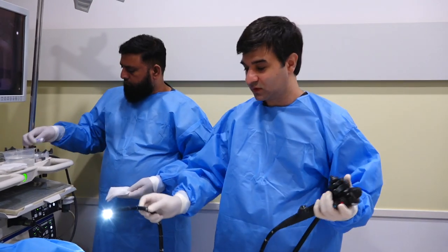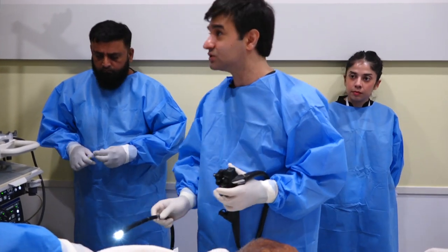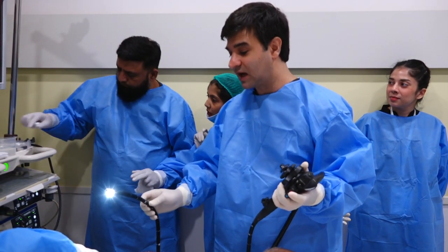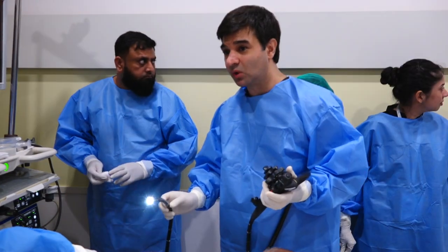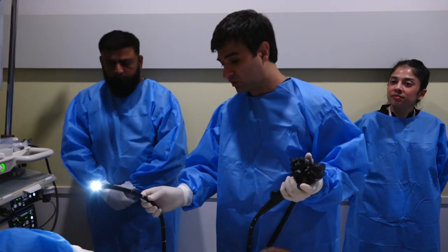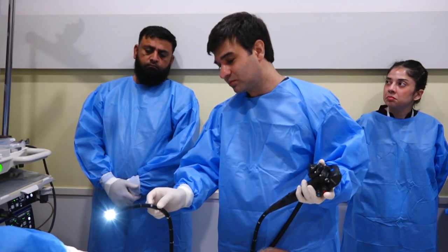Like we just went over, this is a middle-aged man with an intragastric lesion along the lesser curvature. And we're going to do EUS to quickly evaluate it. A lot of what I do is very similar to what Dr. Hassan does, so I won't go through the motions of endoscopy, but the one thing that I do slightly differently is the intubation part.